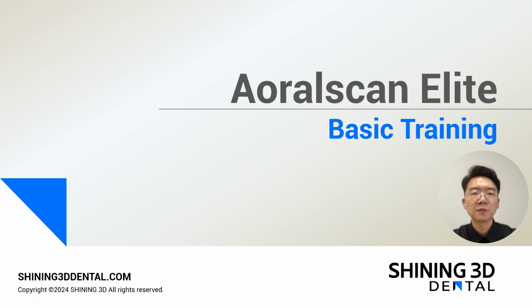The final part of today's training is the clinical case and workflows share. You will see 3 different parts in this final part of the basic training. The first one is the immediate loading for fixed full arch restoration. The second one is final restoration cases for fixed full arch restoration. And the third one is the implant restoration with multi-unit abutments.